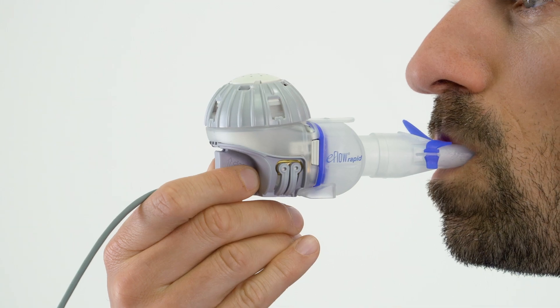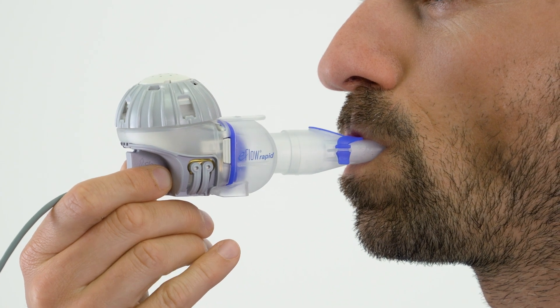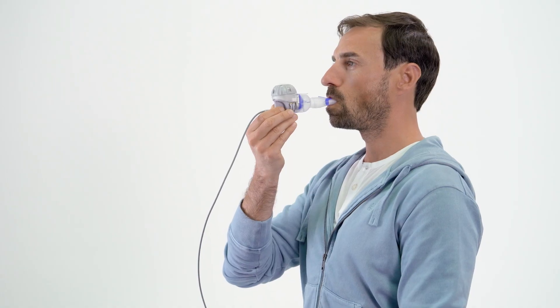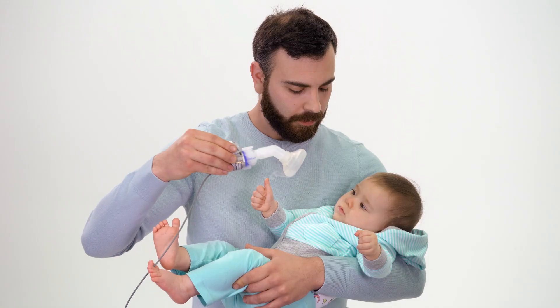Breathe normally through the mouthpiece. It should remain in your mouth during treatment. When you exhale, you'll see aerosol come out of the blue expiratory valve. This is normal. Do not breathe through your nose.